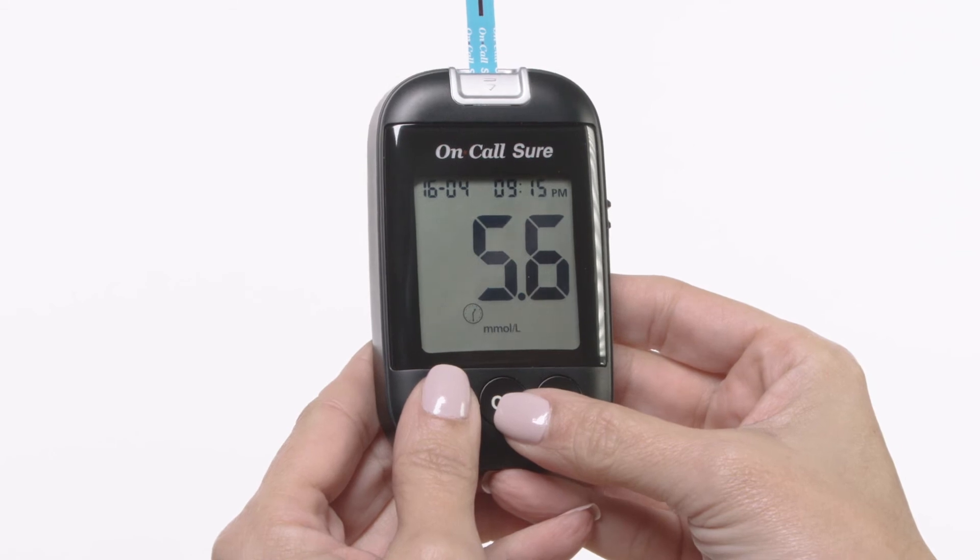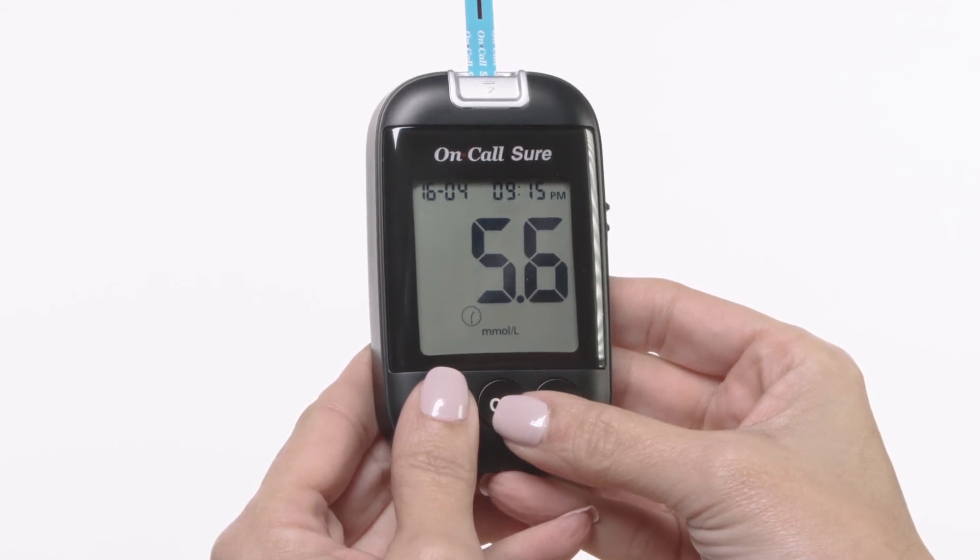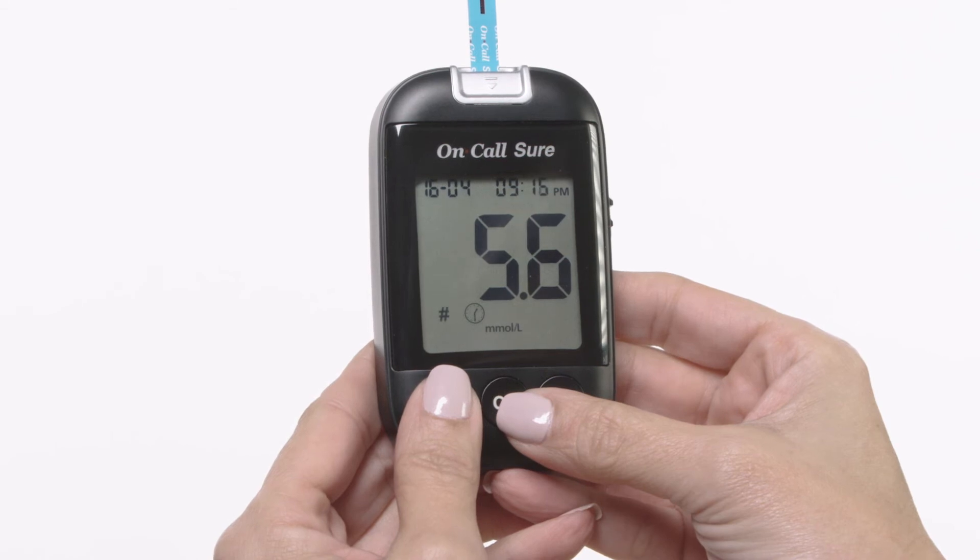A pound sign means that the result will not be included when calculating the 7, 14, 30, 60 and 90 day averages.